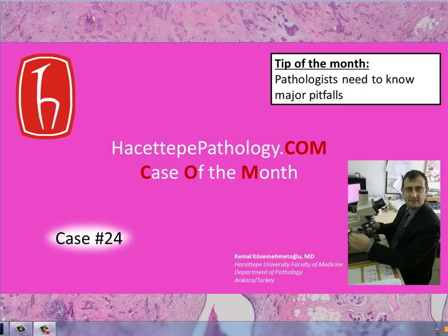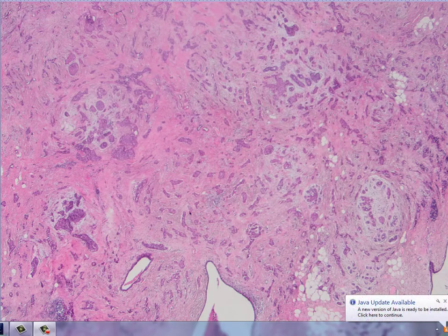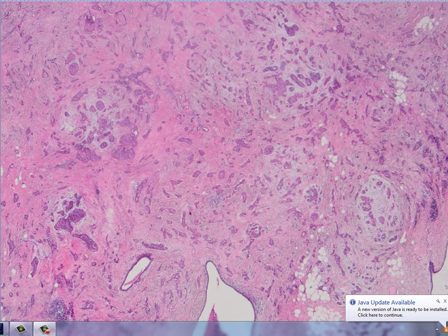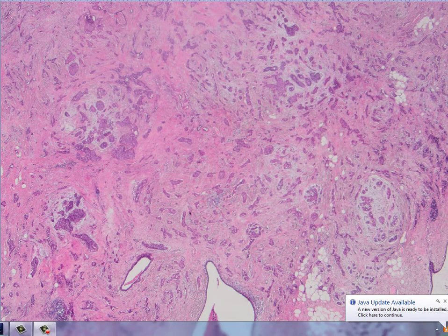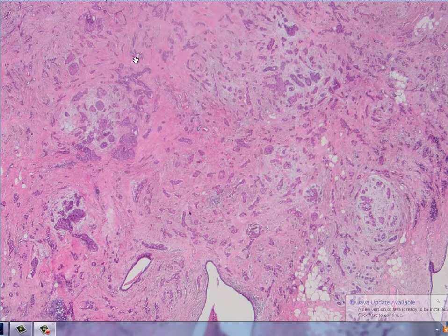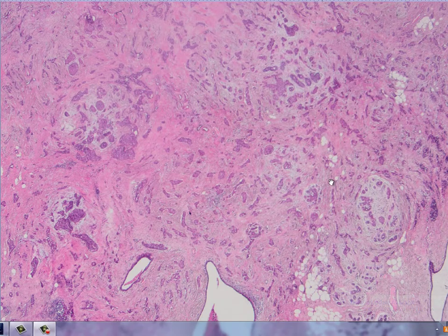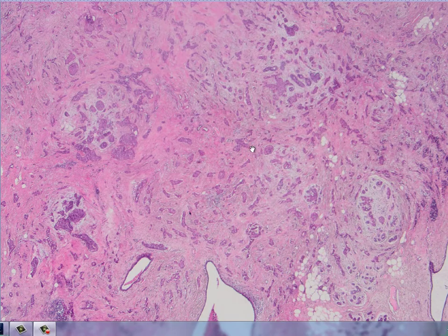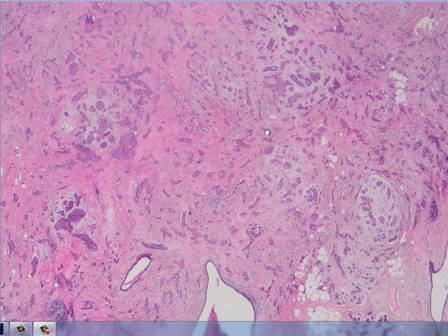Hello everyone and welcome to the hasiotepopathology.com case of the month series. This month I'm going to show you a breast case. As you can see in this very low power field, we have an infiltrative pattern — infiltrative epithelial cells with a desmoplastic background, with some islands of the cells and some trabecular arrangement.